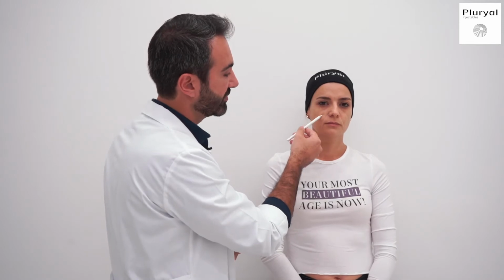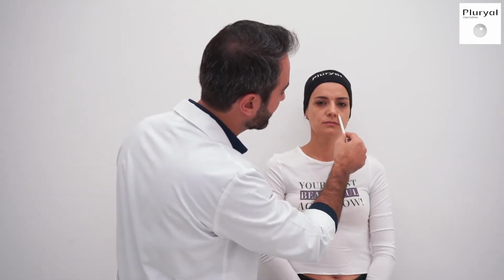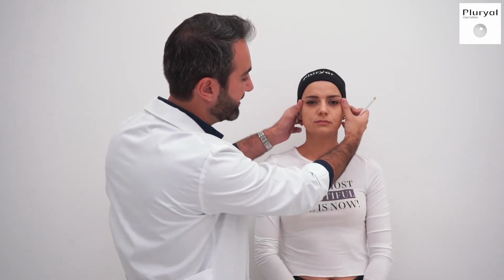So this part, usually we should not inject in it. On the contrary, we have to do a lifting effect of this area to get back the volume to the lateral side. Whenever we do injection of fillers, we have some principles to think of.